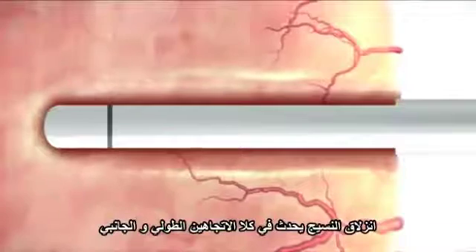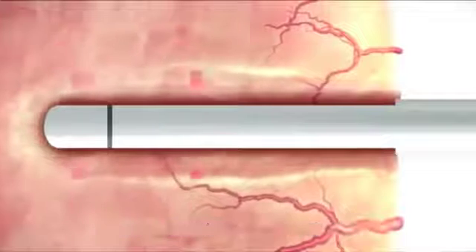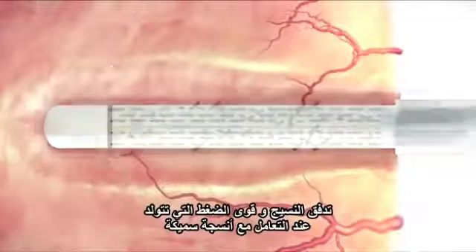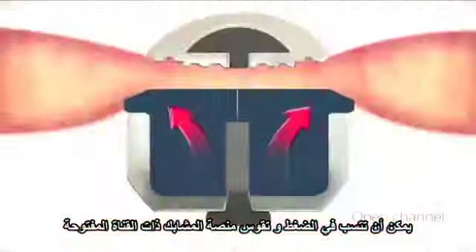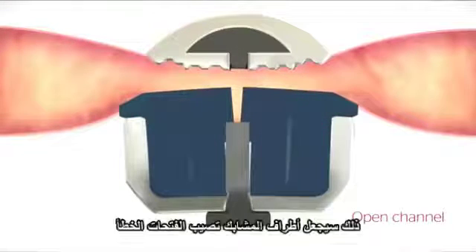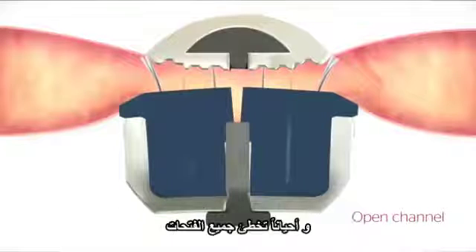Tissue slippage occurs both longitudinally and laterally. Tissue flow and the high forces in thicker tissue firings can cause stress and bowing in an open channel gun, which can result in deck deflection. This can trigger staple legs to hit the wrong anvil pockets and in some cases miss the anvil pockets entirely.